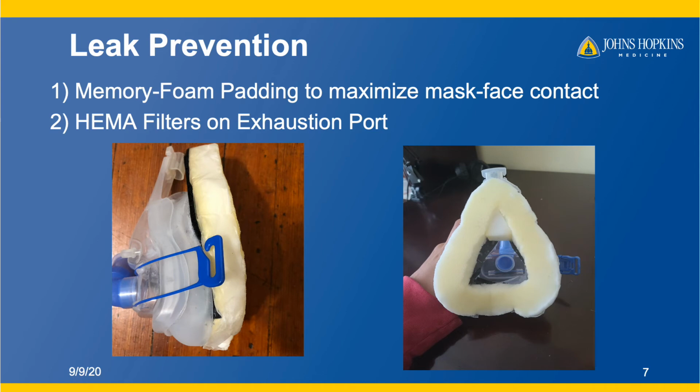to answer the question on how we can then prevent the leaks, we impose two solutions. First is lining the mask with a memory foam pad on top of the standard silicone surface of the mask, so that once the patient wears this mask, the foam will mold around the facial contour of the patient's face, thus maximizing the mask-to-face contact. The second point is that we noticed a substantial amount of aerosol leakage occurs at the exhaust port of the CPAP mask. So we covered this exhaust port with a HEPA viral particle filter to keep the exhausting air exiting the mask free of aerosols.